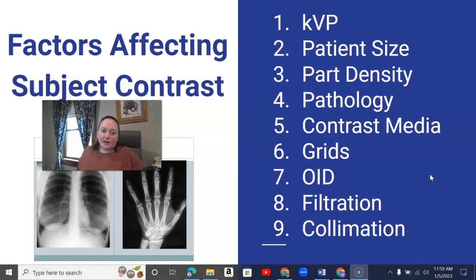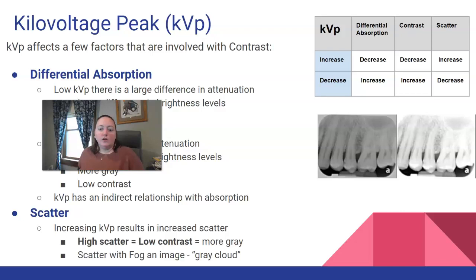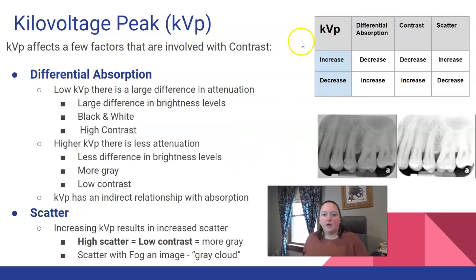All right, we are back with subject contrast. Now, subject contrast, when I hear the word subject, I think of my patient. My patient's my subject. So we're going to go through a few of these factors, some of which as a technologist you can change and some you can't, that would affect that. So kVp, although it doesn't affect your digital contrast, it can affect your subject contrast.